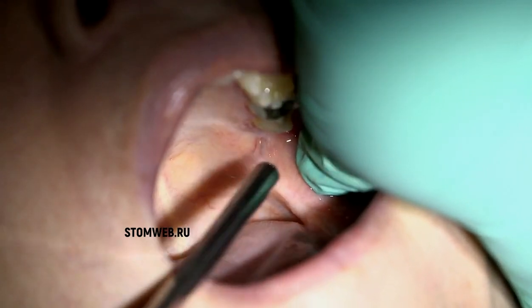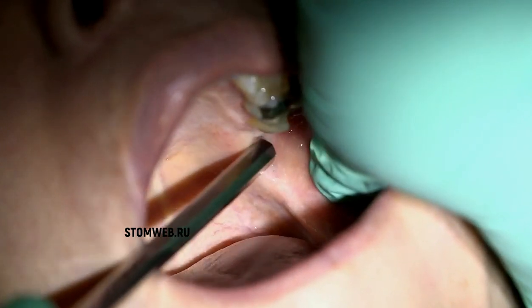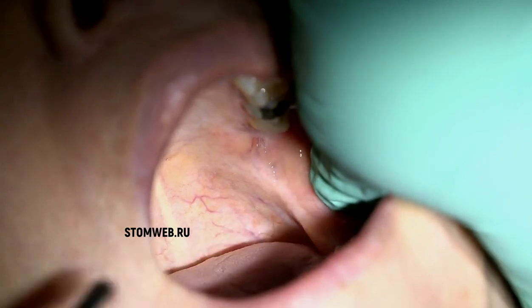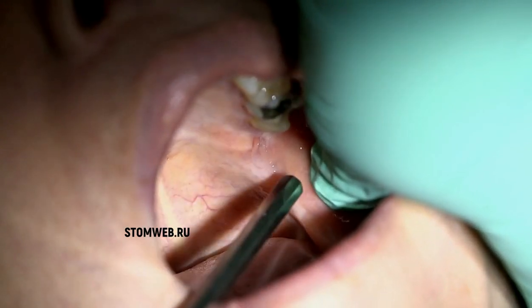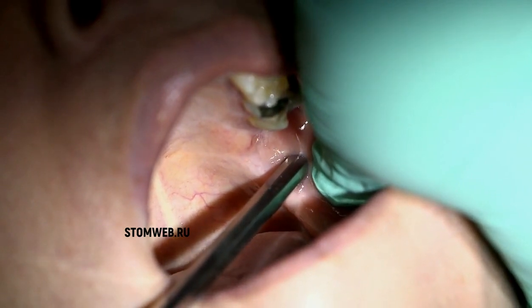Next, we need to identify the pterygomandibular raphe, which is this band of tissue. Then we need to identify the pterygotemporal depression, which is lateral to the raphe. Here we identify the insertion point.